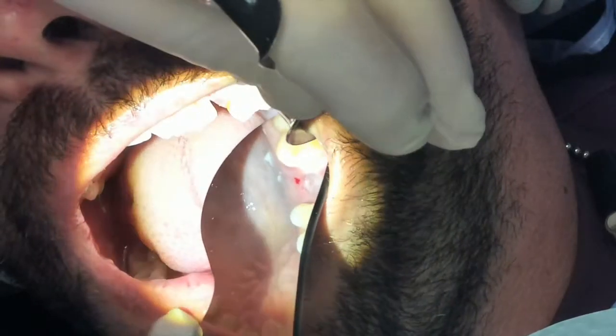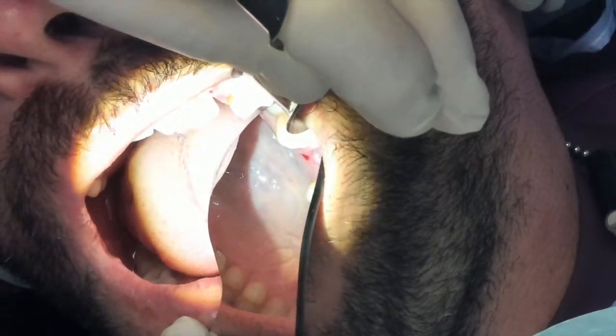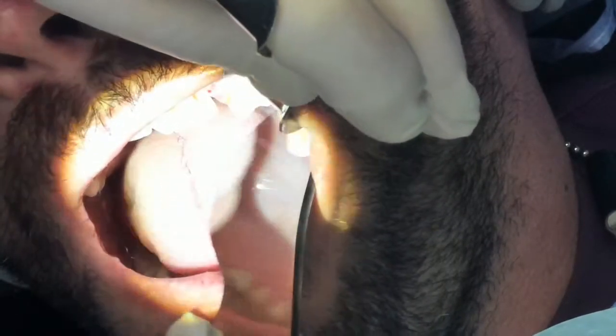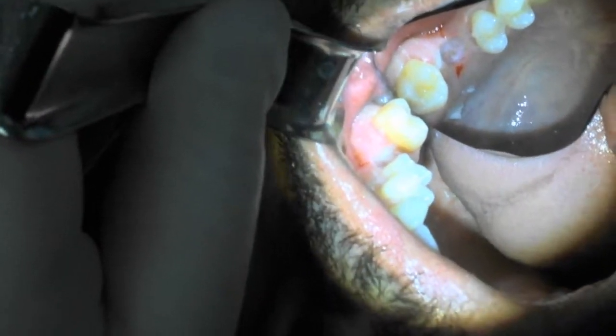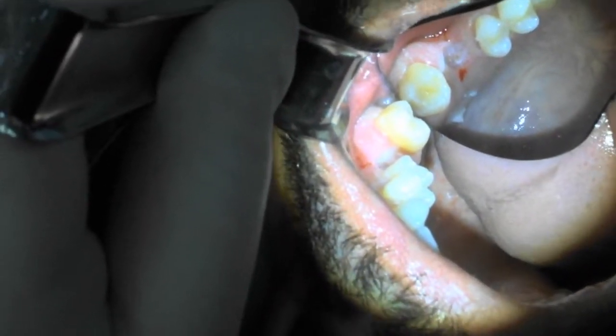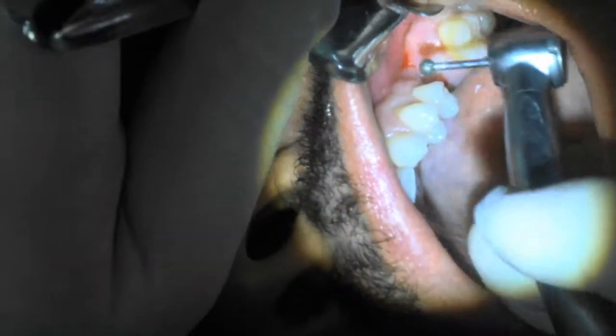So if you see what I'm doing, I'm creating now in the crest of the ridge the ideal site of where this implant should be, and I'm creating that emergence profile in the tissues. You can see already where we have the graft, which is right under the level of the tissue. So what I'm going to do from this standpoint is a little bit more towards me, Matt. Thank you.